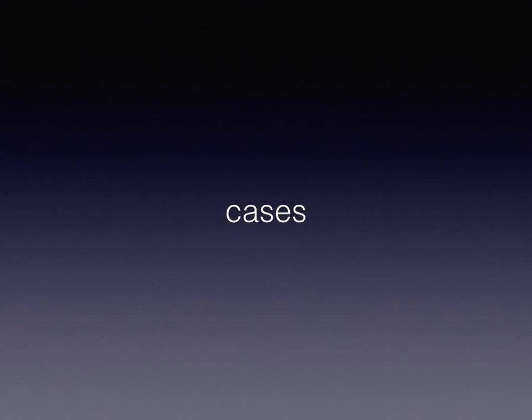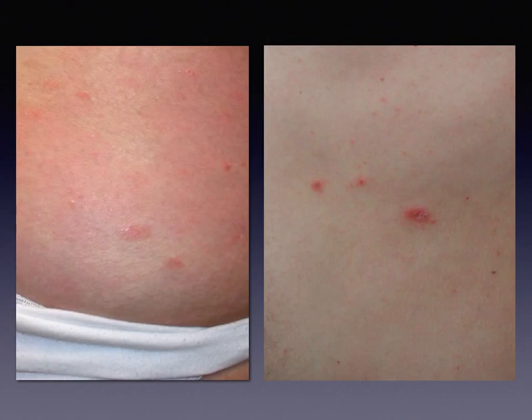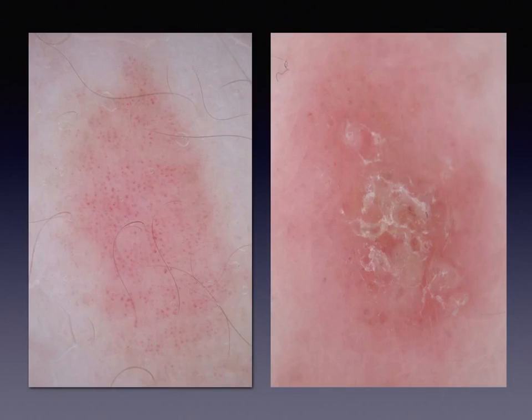At the end of this module, we will see some characteristic clinical examples which highlight the usefulness of dermoscopy in the realm of inflammatory skin diseases. These are two similar papulosquamous eruptions developing on the trunk of young individuals. Their clinical discrimination is virtually impossible. Application of the dermatoscope immediately allows an accurate diagnosis. The lesion on the left displays regularly distributed dotted vessels, absolutely compatible with the diagnosis of psoriasis. Instead, the red dots of the lesion on the right are not symmetrically arranged, and yellow scales are clearly present. This pattern is highly suggestive of dermatitis.